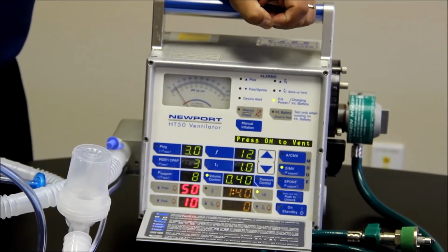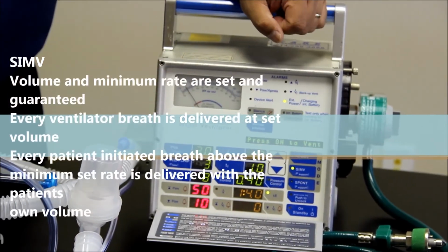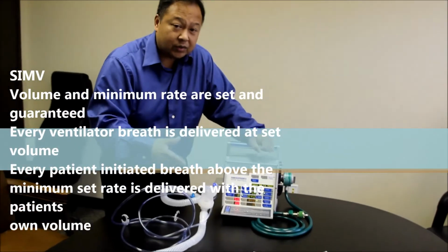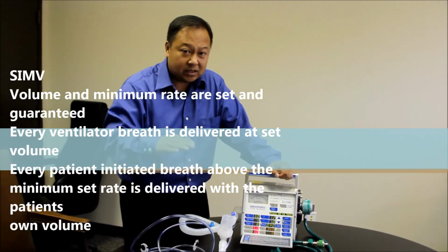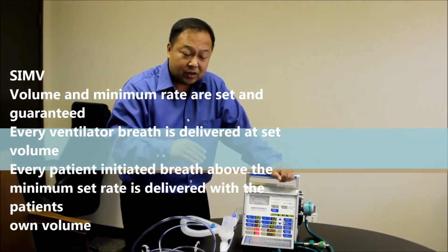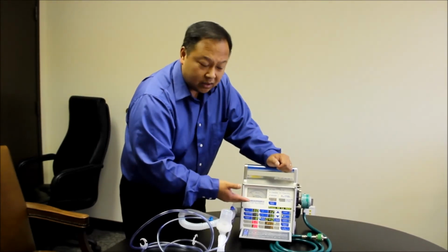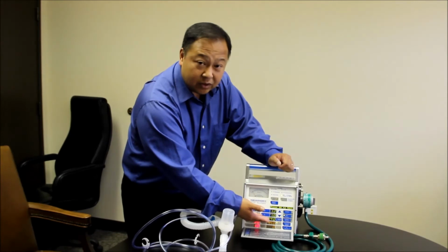Going back to SIMV mode, it allows the patient to breathe on his own. Also, if the patient doesn't breathe on his own, then it'll allow the patient to get the full breath. Say, for instance, the patient's not waking up. So if a patient's not breathing at least 12 breaths a minute, the ventilator will allow the patient to receive the full 12 breaths at the 400 tidal volume.